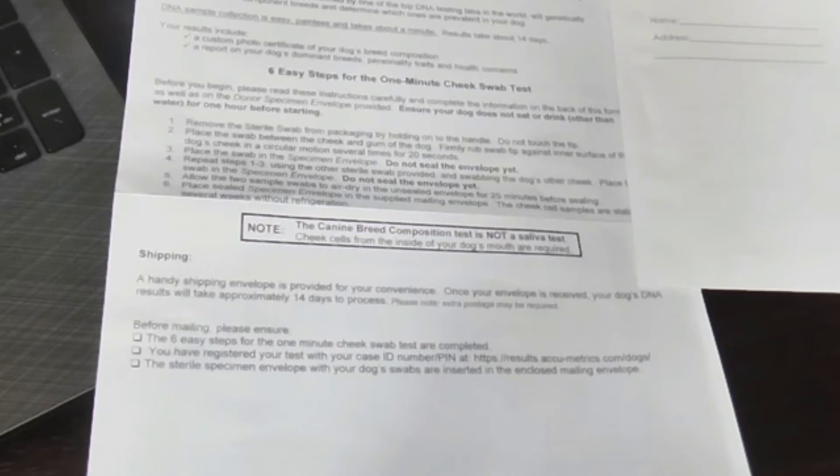They ask you to put in the dog's name and their approximate age, what breed you think they probably are, and upload a photo so they can make the certificate. The company I got it from was Acumetrics.